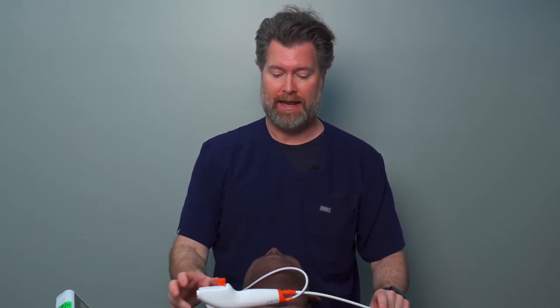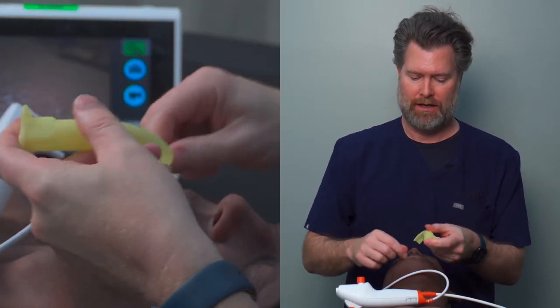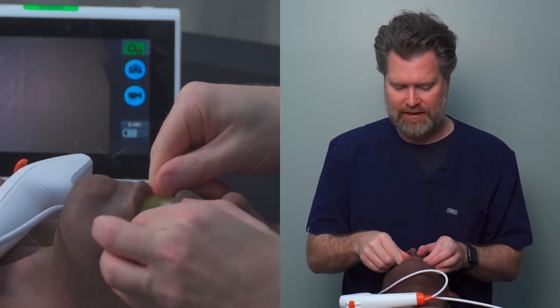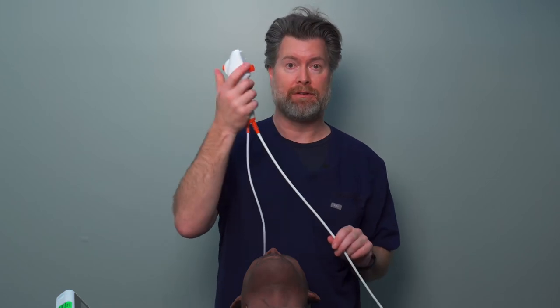One thing I really like using, and recommend for anyone not yet an expert with the Ambu A-Scope or any fiber optic device, is a Williams Airway. As you can see, it's got a ramp and insertion site. You're going to put this in the mouth, distract the jaw, make sure it goes around the tongue — not pushing the tongue back — and then seat it gently midline. This little piece here just rests gently on the teeth.